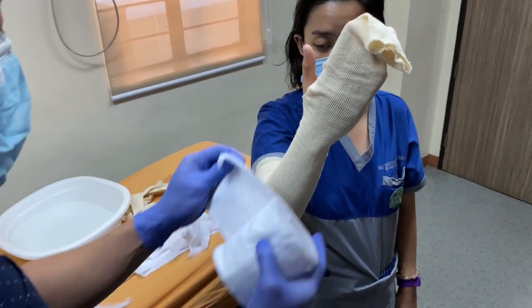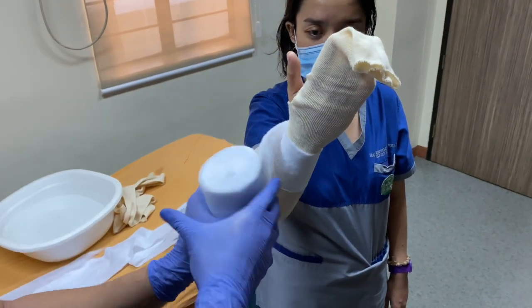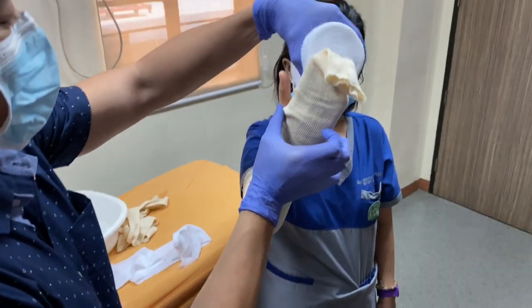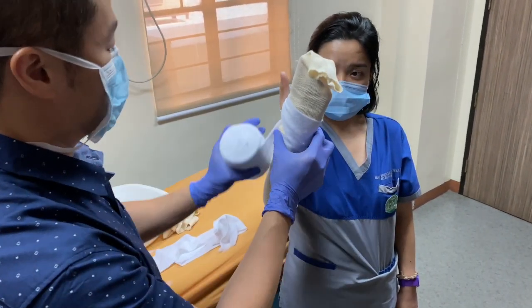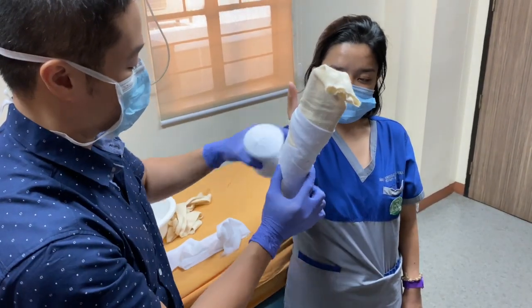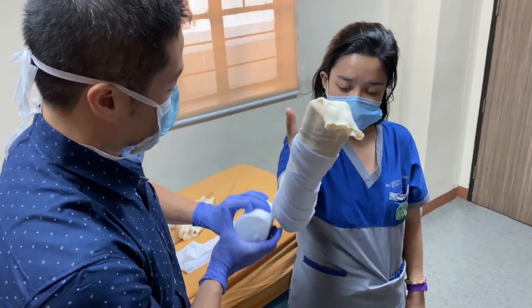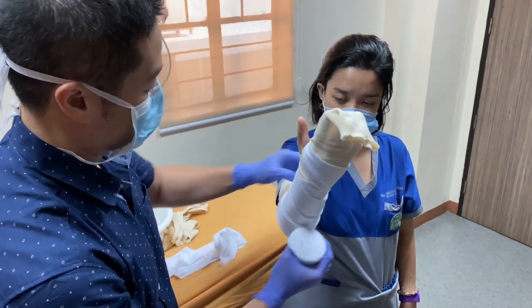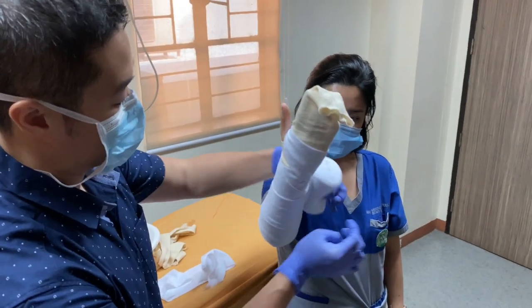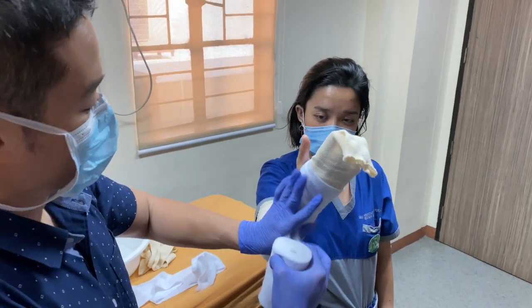Apply padding. Since you already have padding ready for the splint, you can just apply a thin padding over the hand, the wrist, and the forearm, especially on the fracture side. This is one way to lessen the risk of pressure ulcers from your bony prominences.